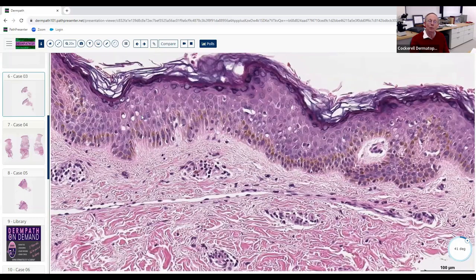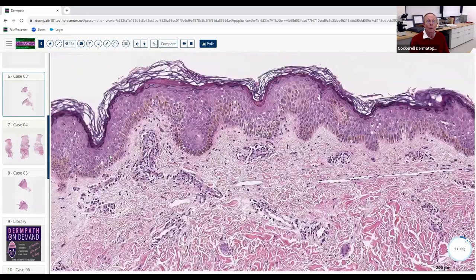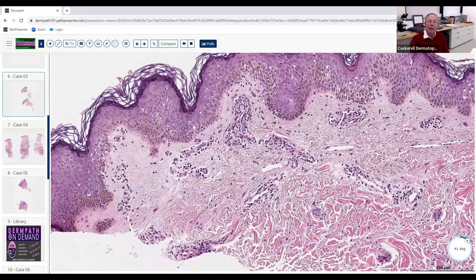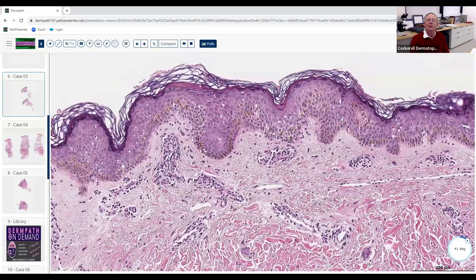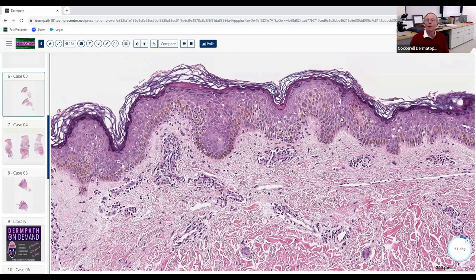I agree — there's some interface dermatitis here, mostly vacuolar. Over here there might even be a few pink cells in the epidermis. This is a tough case — not one you'd likely see on the board unless as a classic example. It's a superficial perivascular infiltrate of lymphocytes with some focal interface change, a little spongiosis, and some dyskeratotic keratinocytes. I'm glad you worked through this because you'll confront this pattern clinically — dermatopathologists struggle with it too, and need clinical correlation.